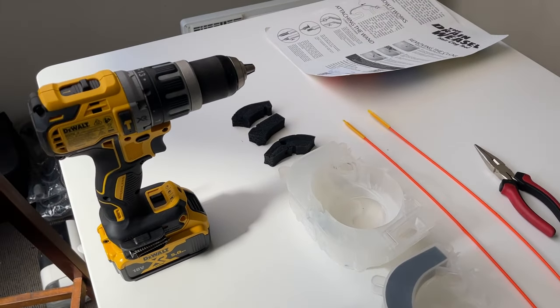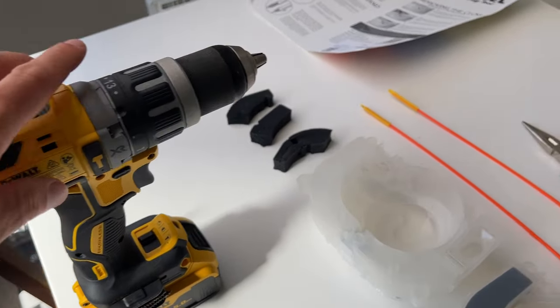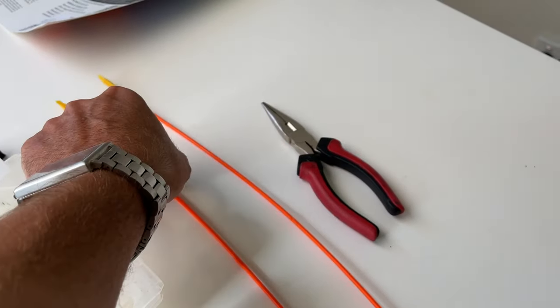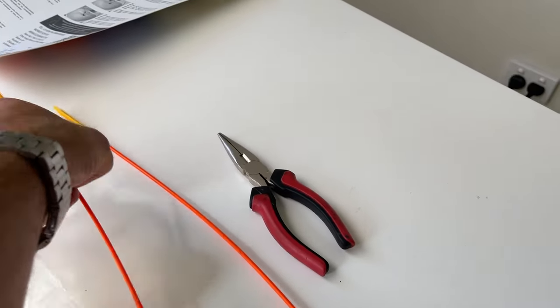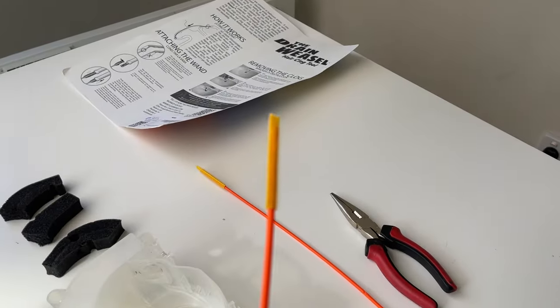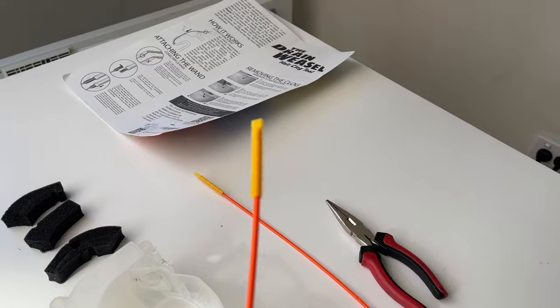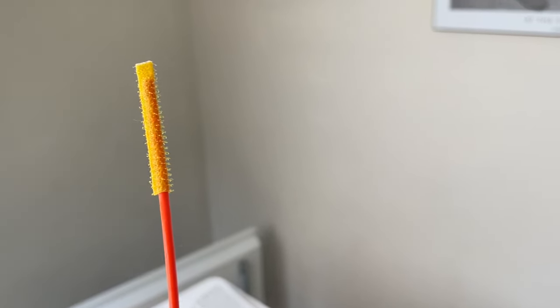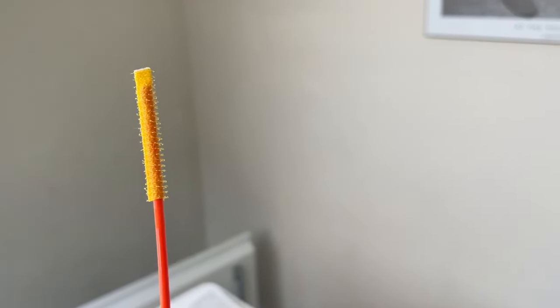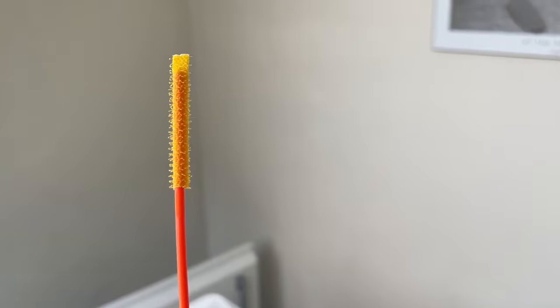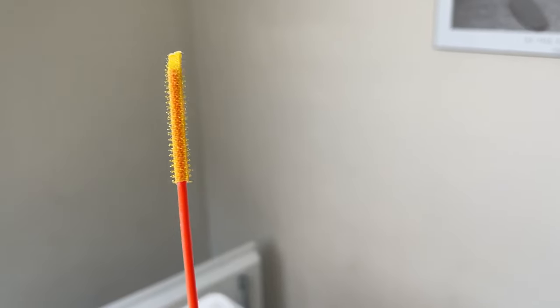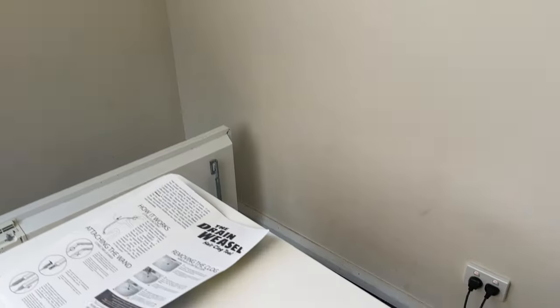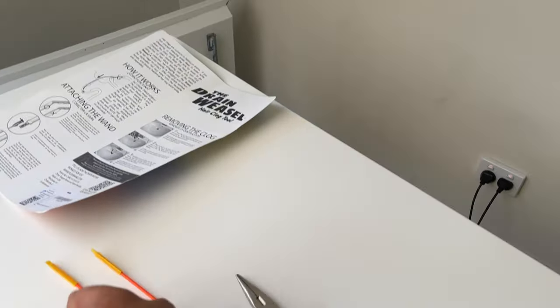So what we're going to need is a drill, these things here, which are called drain weasels, and I'll see if I can zoom in on that, and you can see the end of the drain weasel has little velcro hooks on the end of it. We're going to use that to grab the foam through the holes.